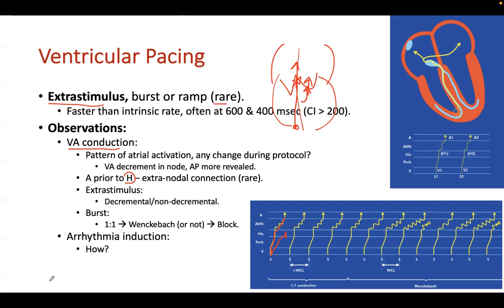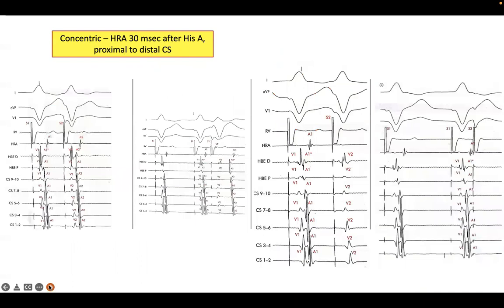So now let's speak in more detail. This is an example, and I need your cooperation here. This is your S1, this is your S2, so you are V pacing, obviously. You see the V is nicely labeled and your A is nicely labeled. Is this retrograde atrial activation normal to you or not normal to you? This is your first question. Anyone can speak up.